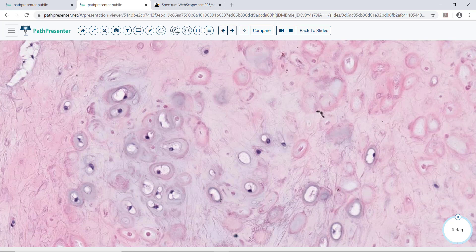You will recall from the lecture that pleomorphic adenoma has a PLAG-1 gene rearrangement.